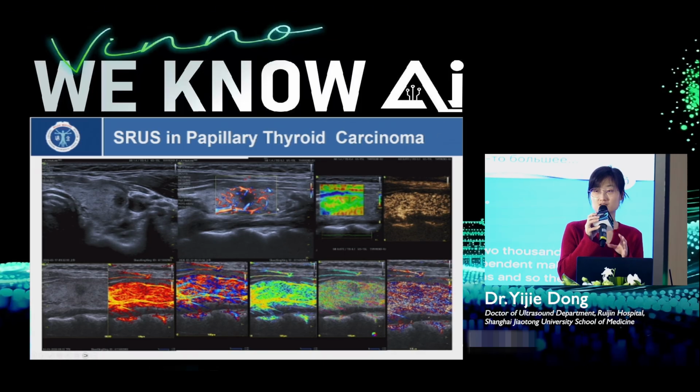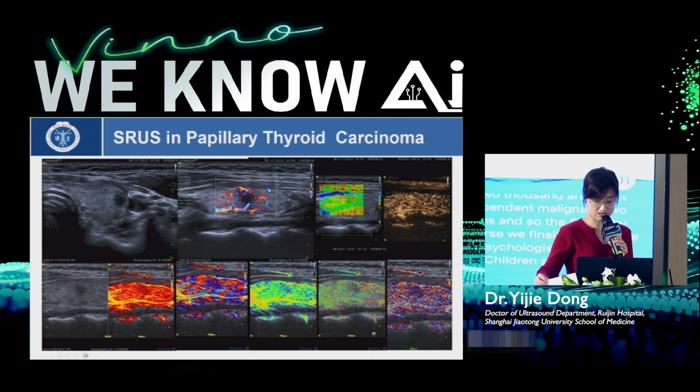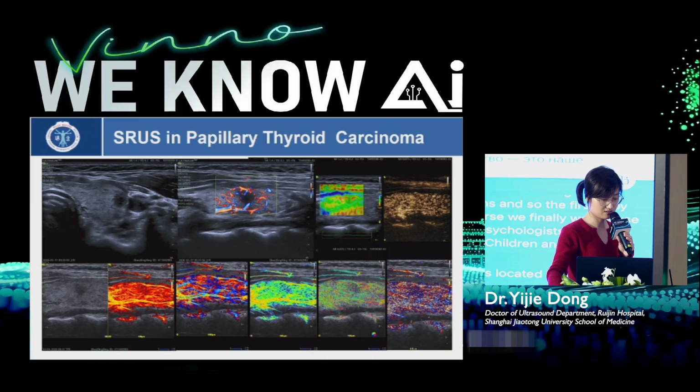Then we can do more during the surgeries. In our department, we do microwave, radiofrequency, and laser ablations every year, and the majority of cases are thyroid carcinomas.